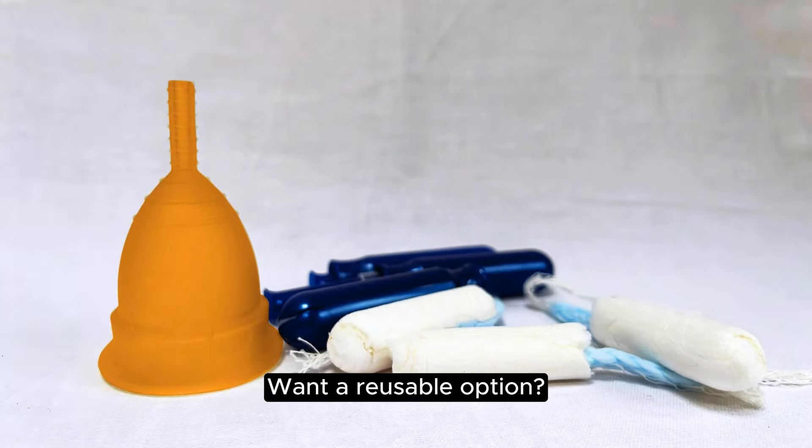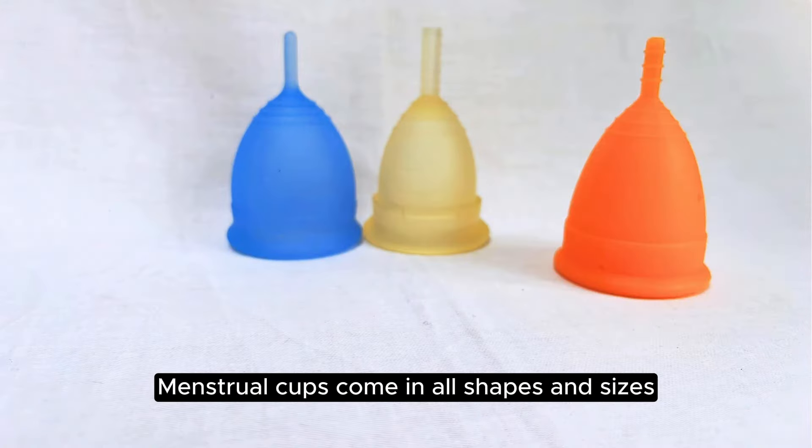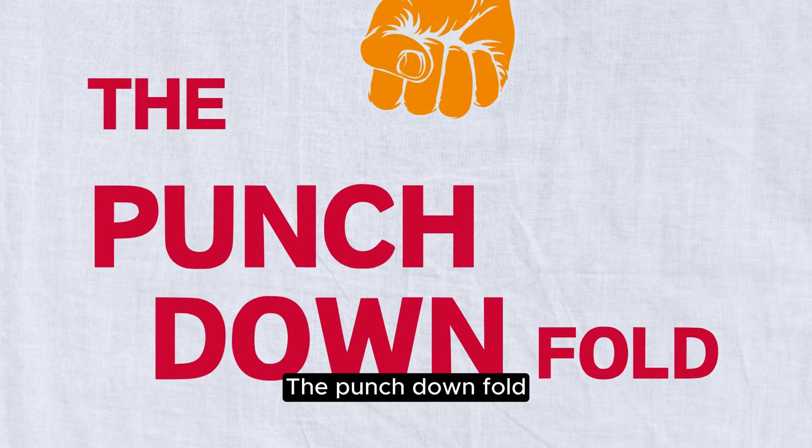If you use tampons want a reusable option, try a menstrual cup. Menstrual cups come in all shapes and sizes, so you can find your perfect fit. To insert a cup, you need to fold it. Try these folds: the punchdown fold.